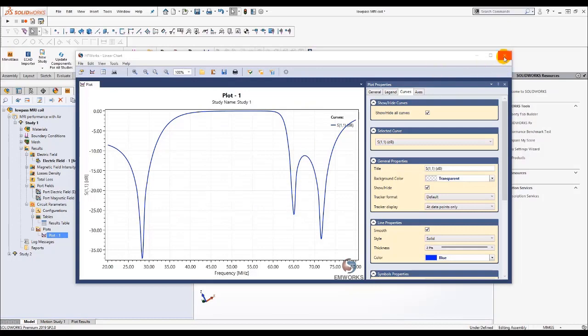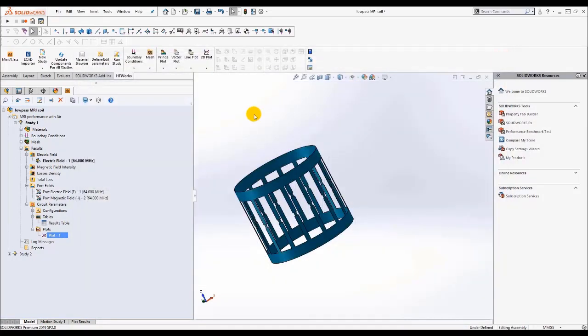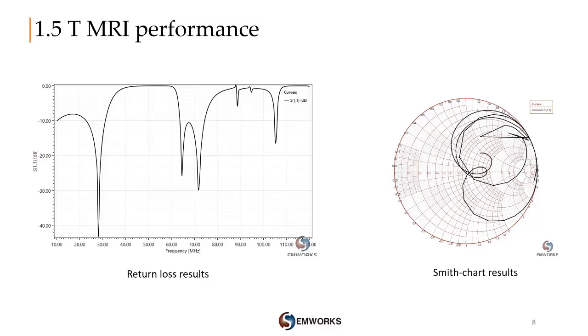So we'll move now to analyze these results. We come back now to our presentation. We have here the return loss result for the studied birdcage MRI design. As we can see, the different resonance frequencies are between 10 MHz and 120 MHz. In our case, we are interested in the 64 MHz, with a high return loss greater than 25 dB. The right figure is showing the Smith chart plot for the same frequency band for the S11 results.